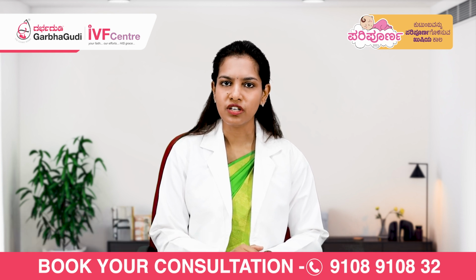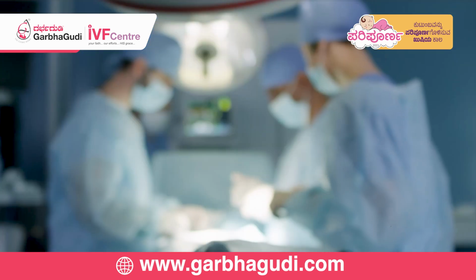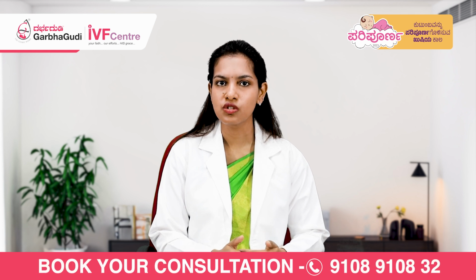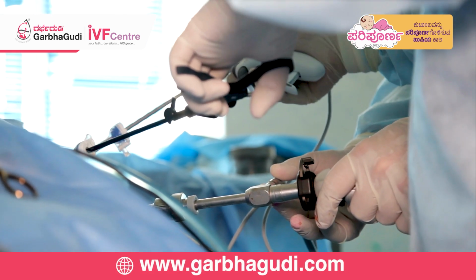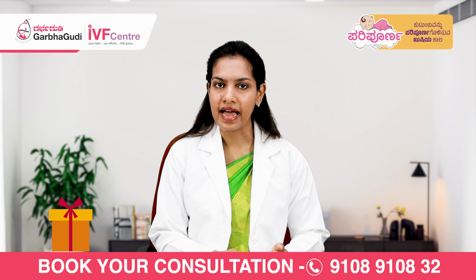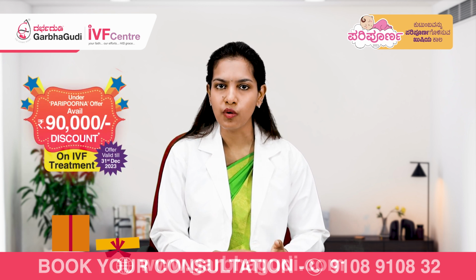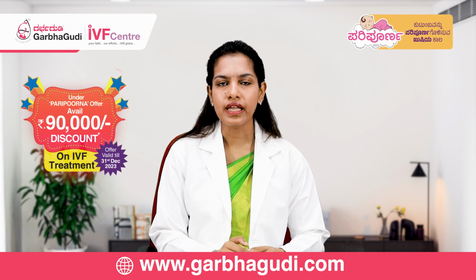So today we're going to be talking about the role of hysteroscopy in IVF. What is hysteroscopy? Like the name suggests, it means looking into the uterus with a scope. This scope has a camera and a light attached to it and helps us look into the interior of the uterus. So we get information about the cavity, the lining, the endometrial glands, and any abnormality that might be present, like a fibroid, a polyp, any Mullerian anomalies like a septum, or any adhesions.